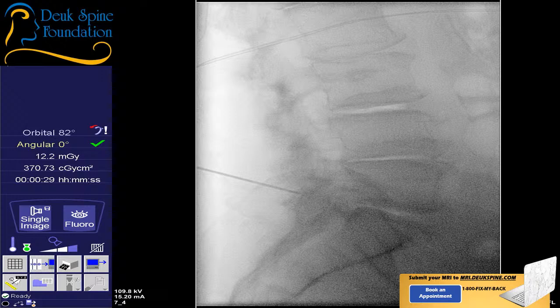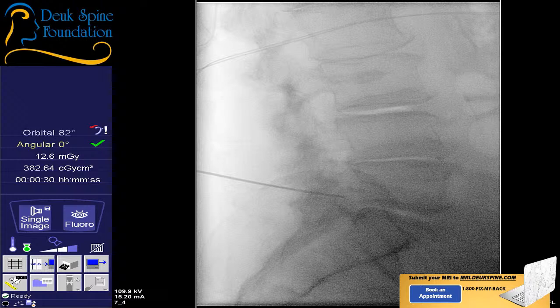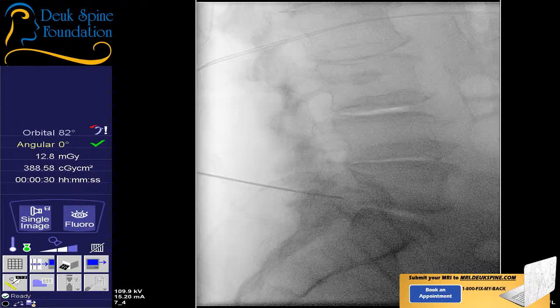You know, I heard everything in Texas is big, and what you're showing me is what's called a big curve. You know what a big curve is? No, it's not good. You have a big curve to your spine. But don't worry, we're not giving up easy. We're gonna get in there. You just lay still and we'll get it done, all right? Let's get an AP.